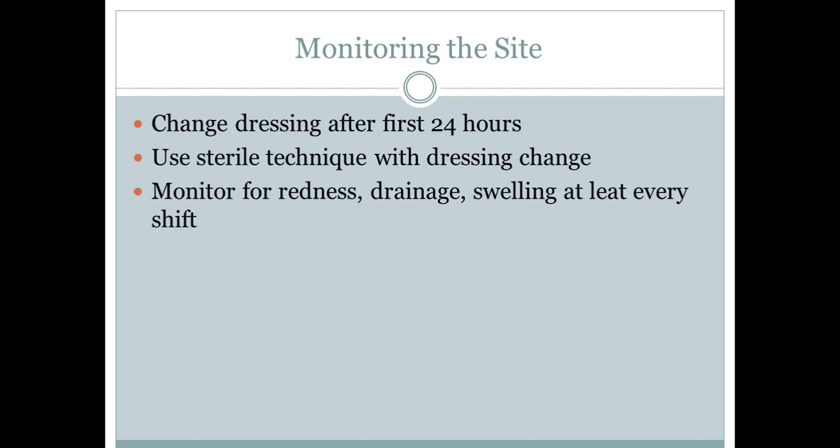you're still going to have that increased risk of infection. At the area of insertion, obviously, we're going to be looking for the same things like we do with the peripheral IV. We're going to be monitoring for redness, any drainage at the site, any swelling, and we're going to be monitoring that at least every 2 hours, or excuse me, at least every shift. So it's important that we are keeping track, and then we're also documenting those assessments that we do, because again, if it's not documented, it is not done.